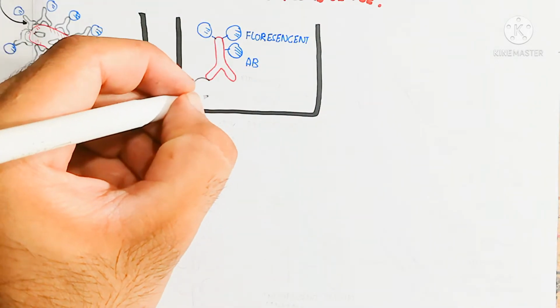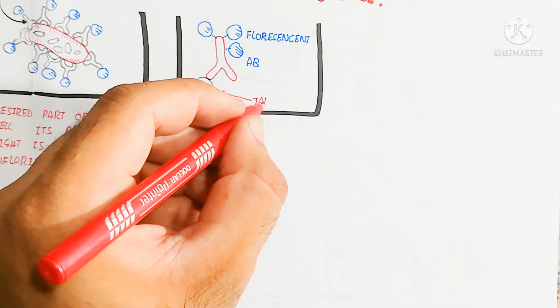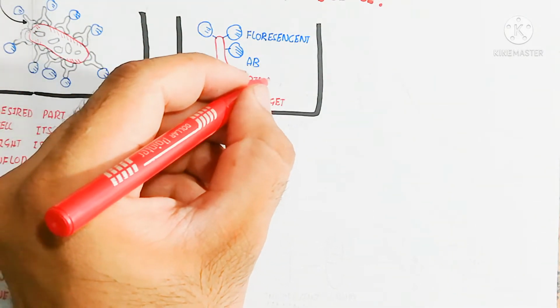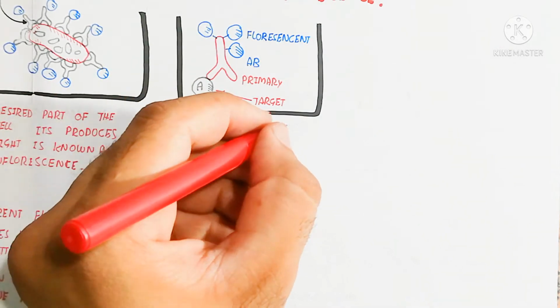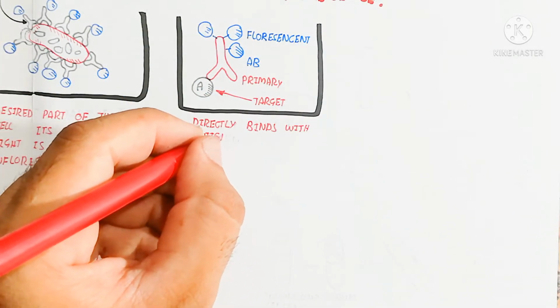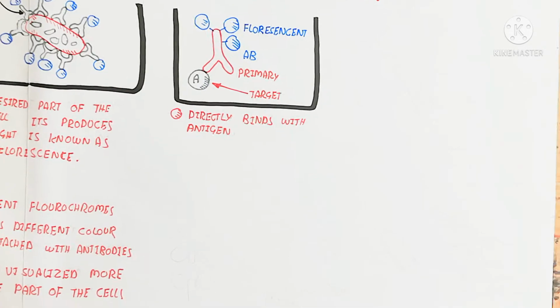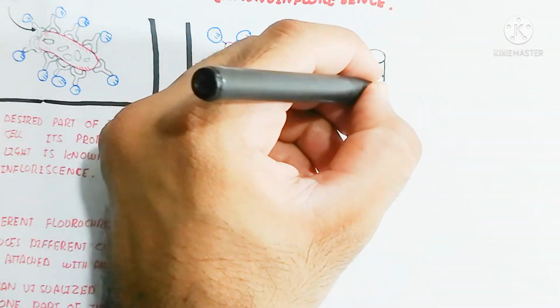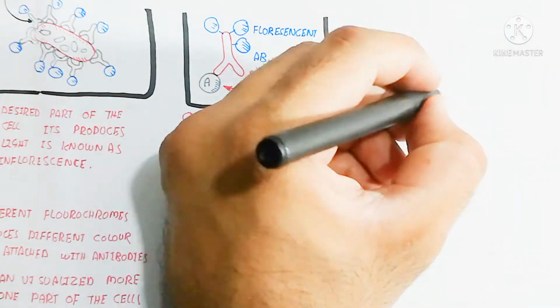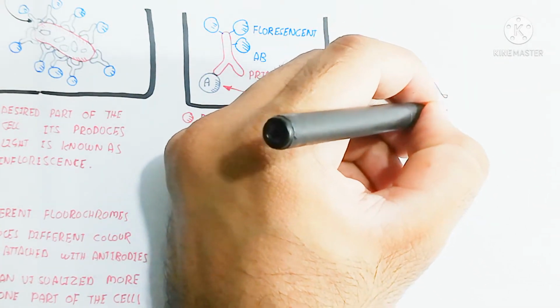But the major problem is that it is less sensitive. So we want a more sensitive reaction, with more light emitting.